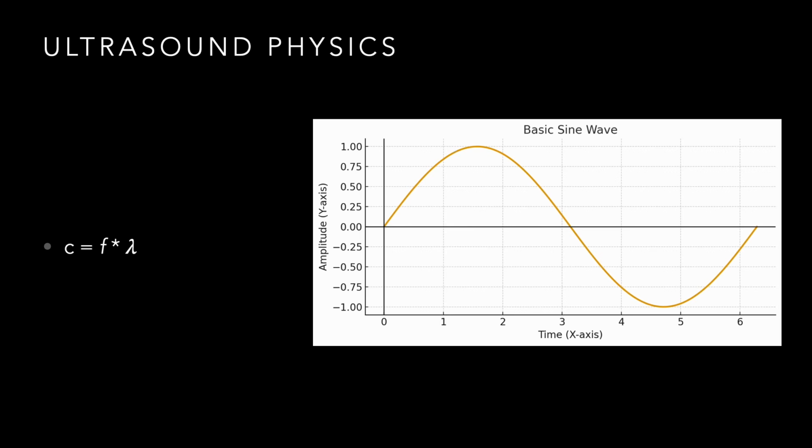And when we're talking about ultrasound, we're talking about things in the megahertz. So it's 1 plus a lot of zeros in terms of how fast that happens in a particular second. But we can break it down to this sine wave of it goes through 1 cycle per second. Now, this is the fundamental assumption of all ultrasound, right?